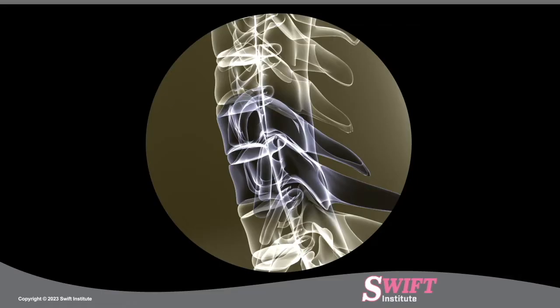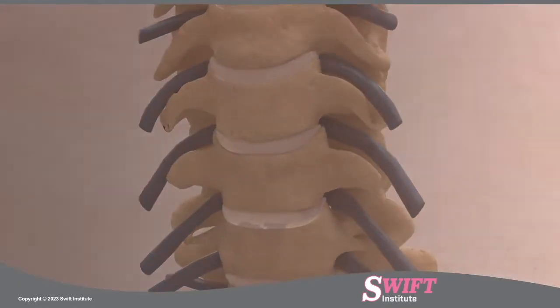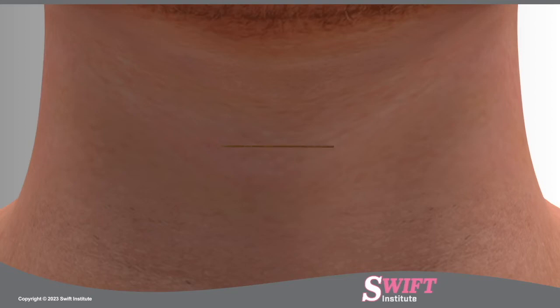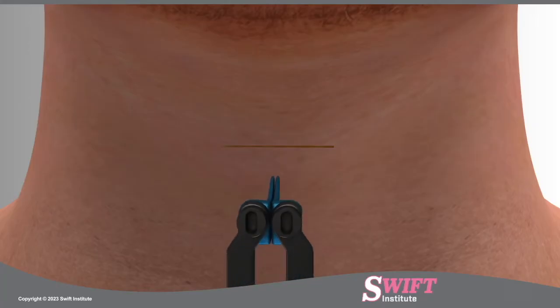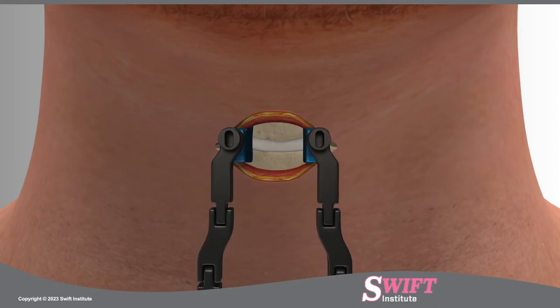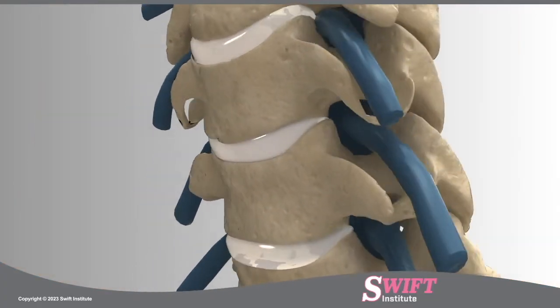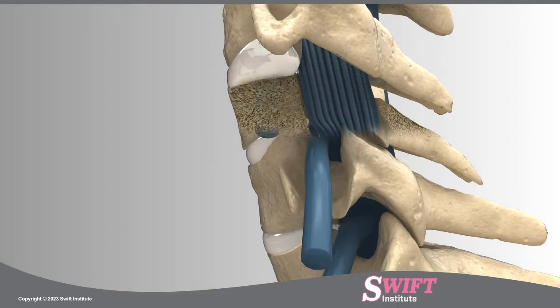Using fluoroscopy, a special type of x-ray, the level of the injured disc is located along the spine. A small incision is made in the anterior or front part of the neck. At Swift Institute, a custom self-retaining retractor is carefully placed. This anterior approach allows the surgeon excellent access to the disc, with less disruption of muscle, resulting in less pain post-surgery and a quicker recovery once the disc is exposed.